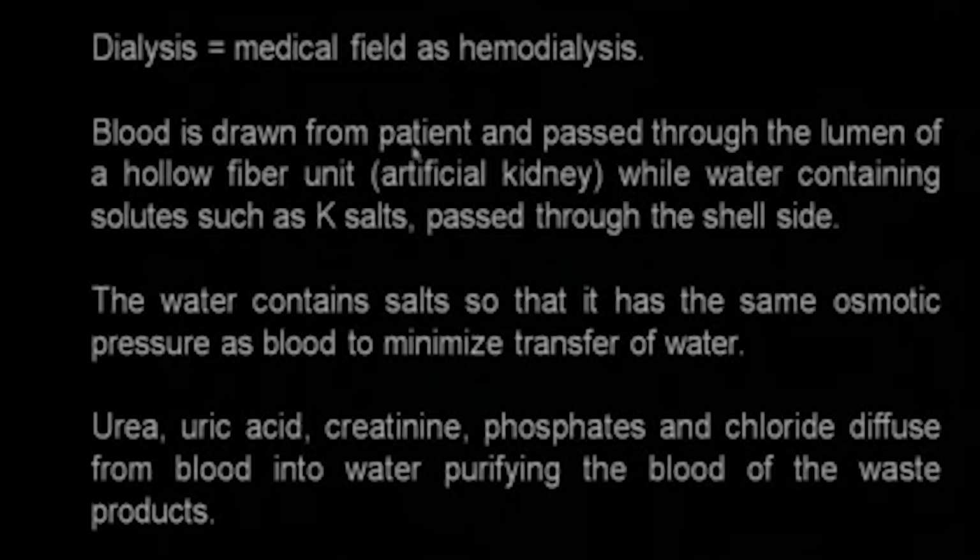The blood is drawn from the patient and passed through the lumen of a hollow fiber unit. There is a long hollow fiber. Water containing solutes, such as potassium salts, that is called the dialysate, passes through the outer side, that is the shell side.